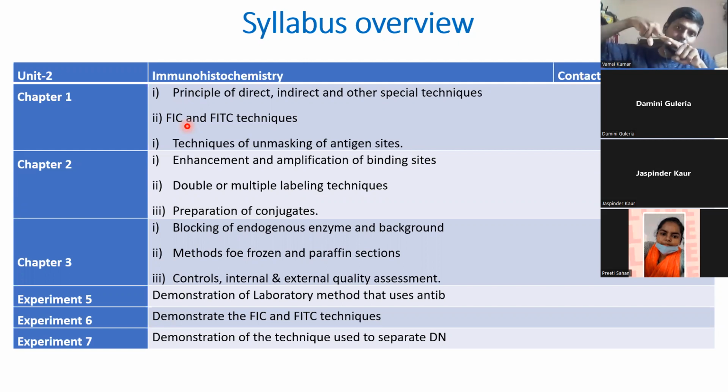Upon adding my antibody, it will develop color because peroxidase is already present in the tissue, and it will give false results to us. We will think, yes, my targeted antigen is present. Actually, the color developed not because of the antigen, but due to the peroxidase already present in the tissue. So in such scenarios, we need to mask those peroxidases.